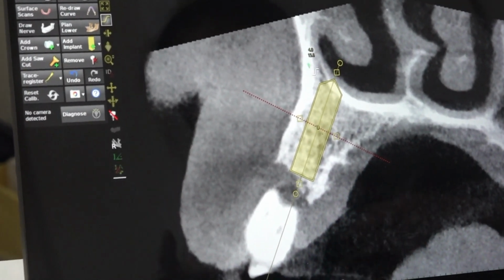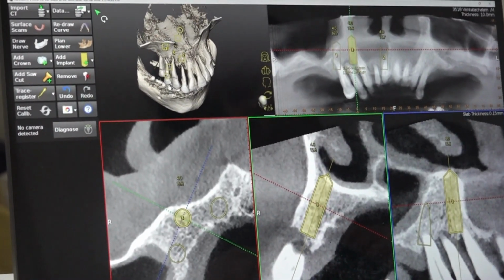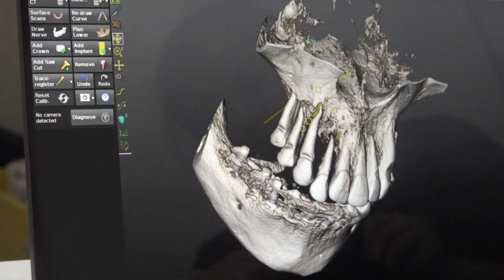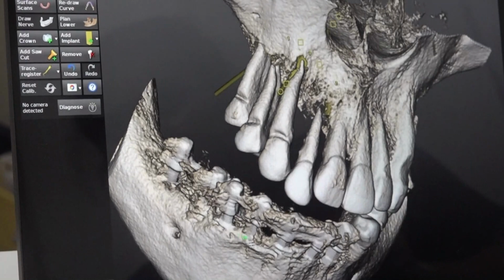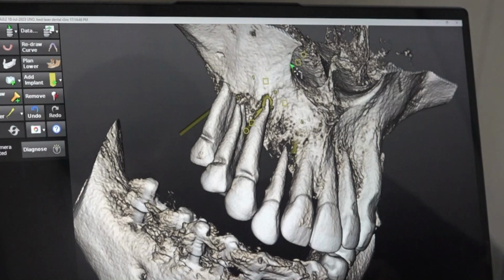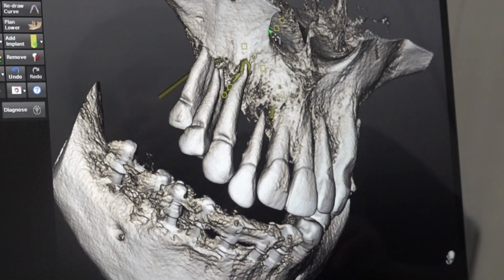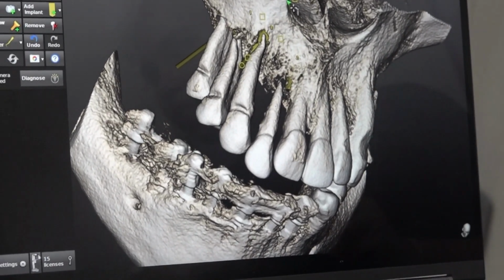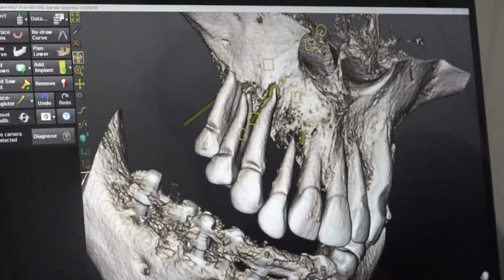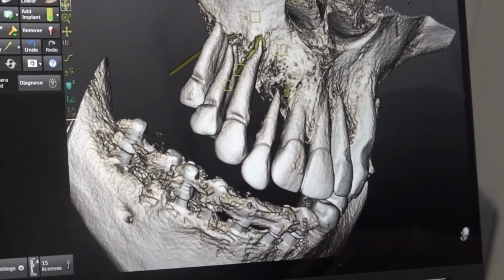So this is the canine line, right? Almost the nasomaxillary buttress. So what you can do is, see, if you see it, this is the buttress. So in this area you have to come close to labial. You should not perforate and come out labial, close to labial. That is why opening the flap is good. In this kind of situation, it is better to open the flap till the nasal floor. You have to expose the lower border of the nasal floor also, and you can see the nasomaxillary buttress also.